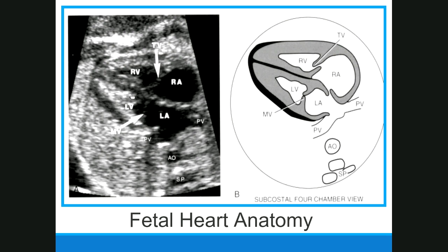As we go through, I'll show you a trick that can help you differentiate the right ventricle from the left ventricle, a kind of cheat sheet, because it can be difficult to differentiate left and right. But you have to remember to look at an image like this in its entirety. Where's the spine? Where's the aorta? That can help you determine left or right. If I know the aorta is here, I also know that the left atrium is the chamber of the heart that lies closest to the spine. Then you can talk yourself through determining whether or not what you're seeing is normal or abnormal.